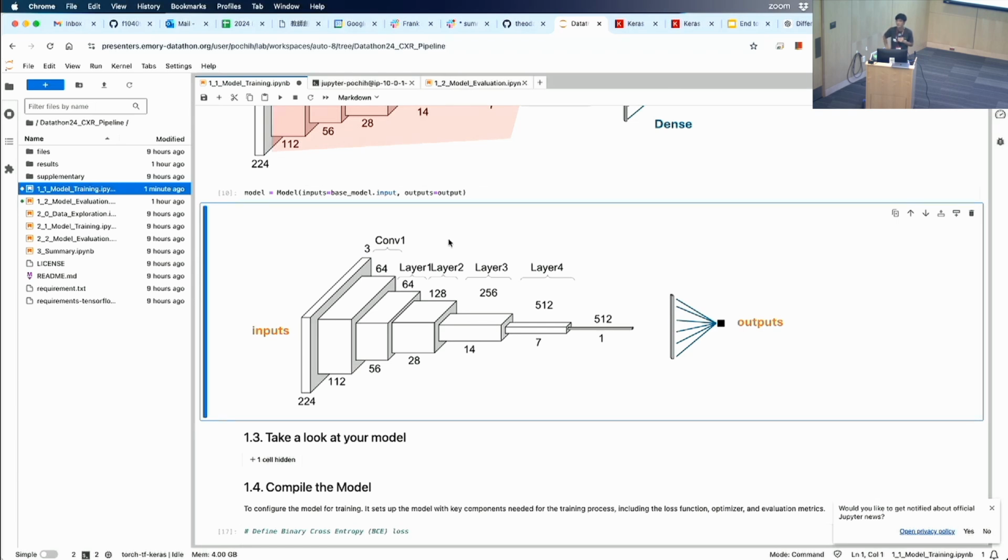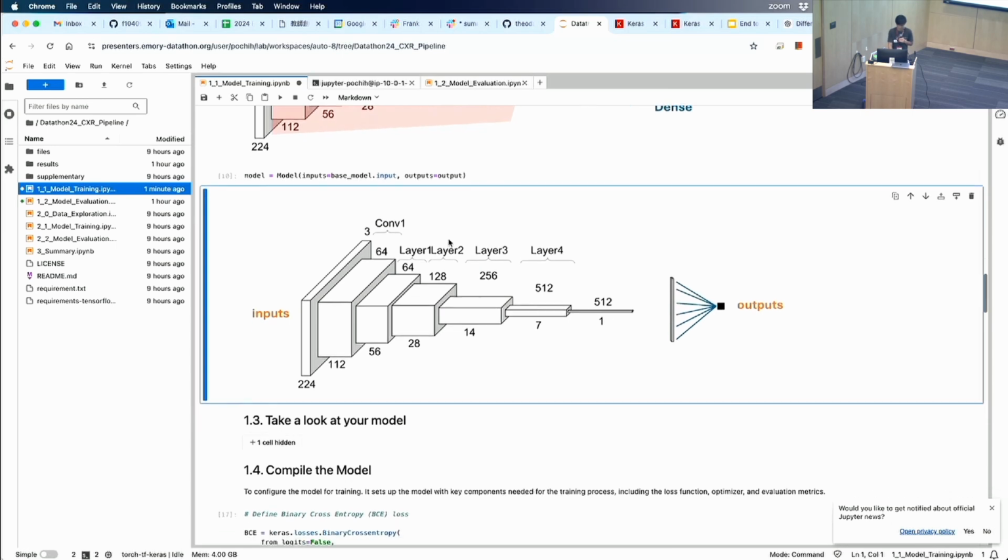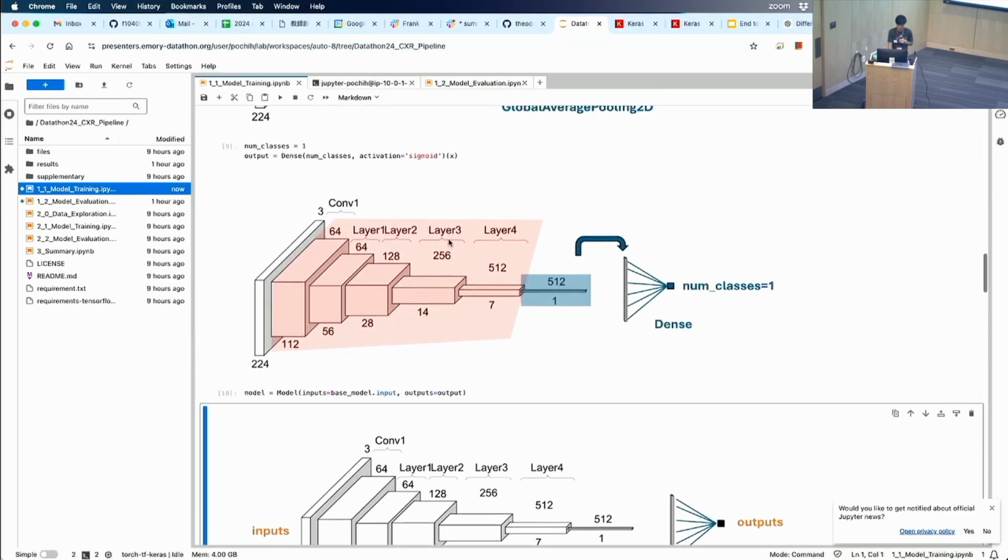So one of the skills you have to learn, and today it is an easy skill to learn, is how to read code. You have to be able to go through people's code and read it. It's easy today because AI can help you do that.